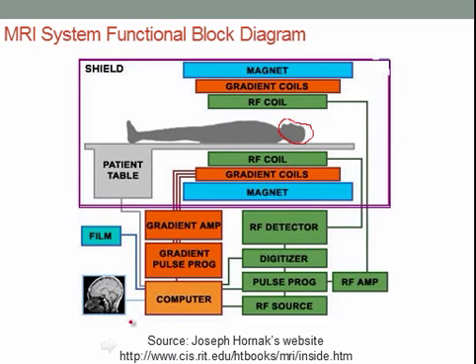So what else do we have down here? In a different room, you would have these components, the gradient amp. Actually, there are 3 of these, one for X, one for Y, and one for Z. And let's see, does he show the RF amplifier? Yes. In the other room, being an electronics room, you would typically have cabinets.